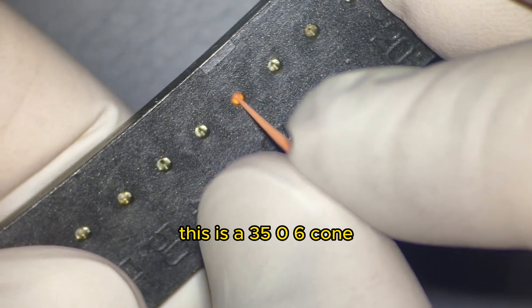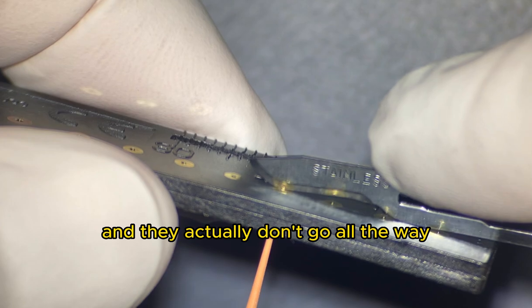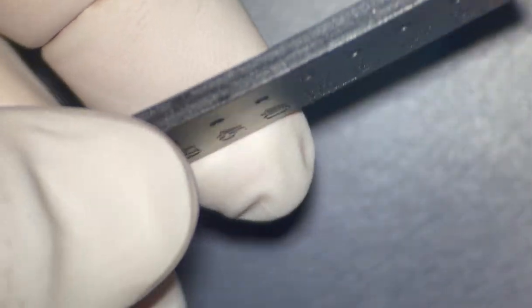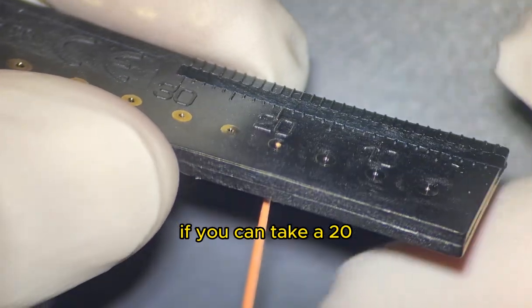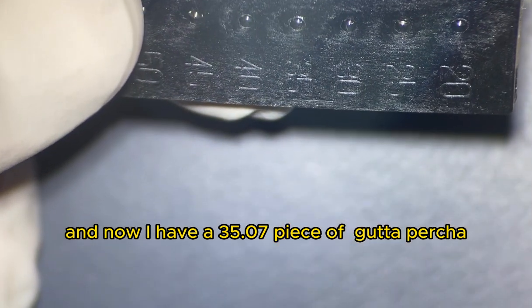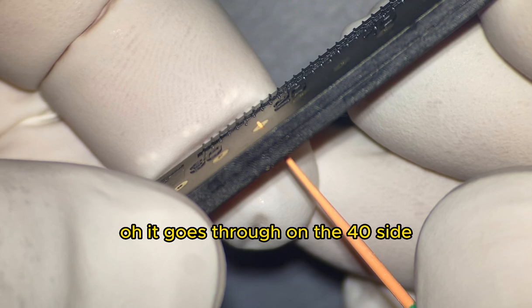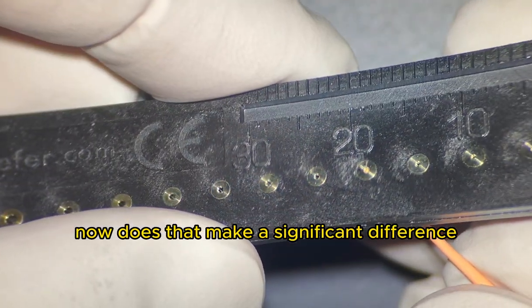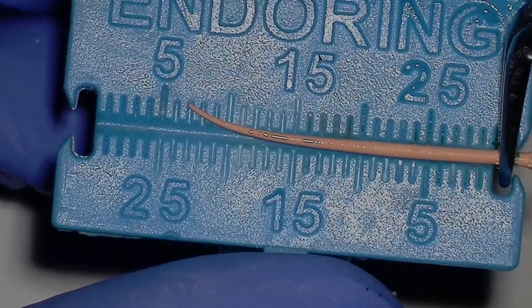For example, this is a 35/.06 cone, a medium from Wave One Gold. Let's place it in the 35 slot — and I checked a whole bunch of these — they don't go all the way to the other side. If you put it in the 40-size hole, it goes through. So it's behaving more like a size 37. You can cut a gutta-percha from a 20 to a 35 and now have a 35/.07 piece. So maybe this is more like a 37/.06. Does that make a significant difference? Probably not in the long run, but if you're routinely short, you can use a gutta gauge to figure out the actual size of your gutta-percha.